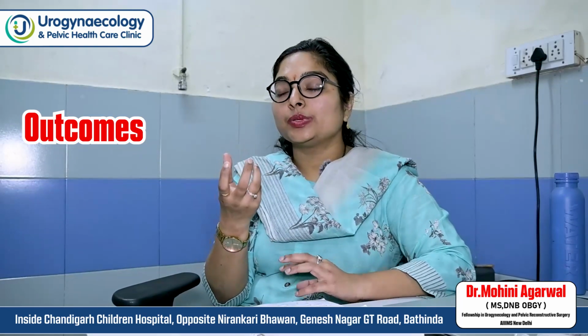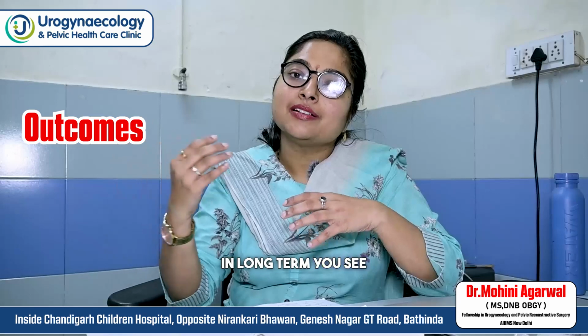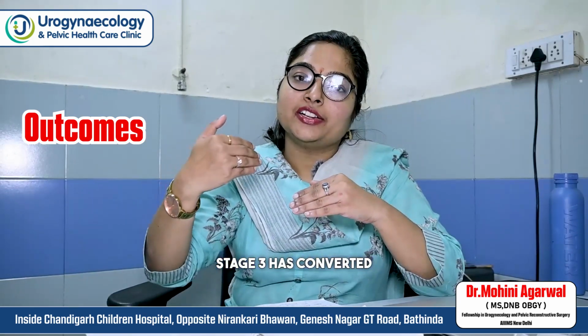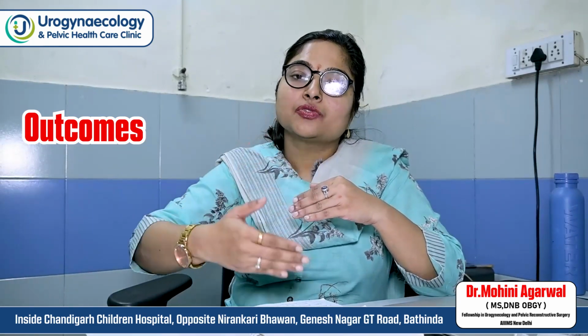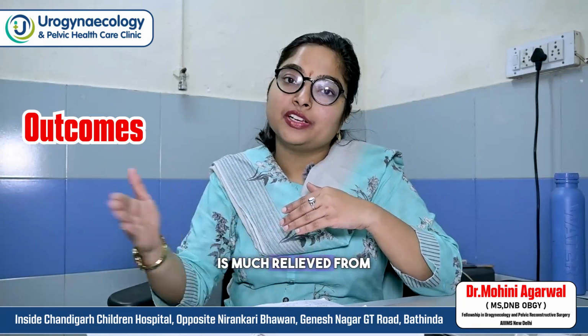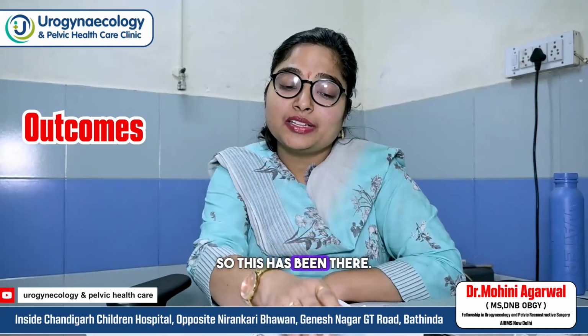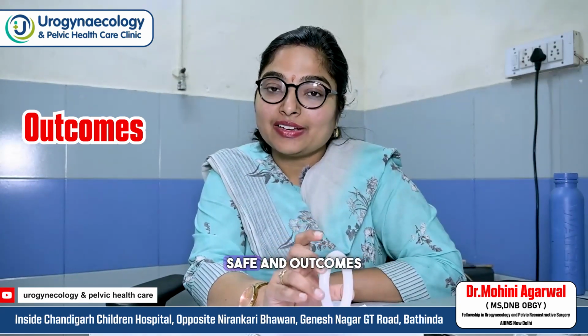Basically the pessary works through the action of fibrosis. So whenever you insert a pessary long term, you see stage 3 has converted initially to stage 2, then 1. So when you see the patient in follow-up, the prolapse actually goes away and the patient gets much relief, and the patient uses the pessary for years and years. So as such, it is very safe and outcomes are good.